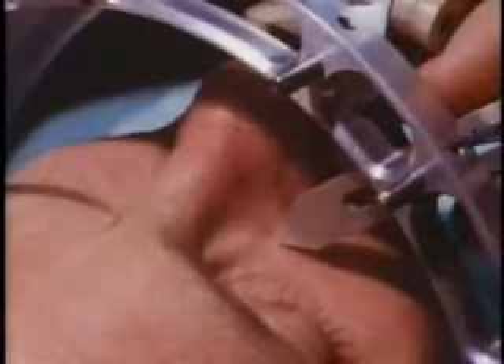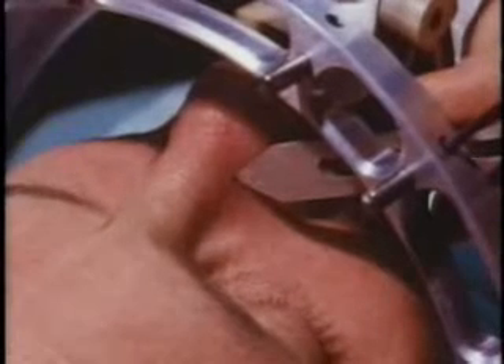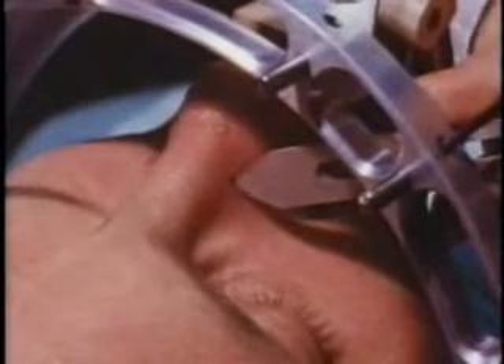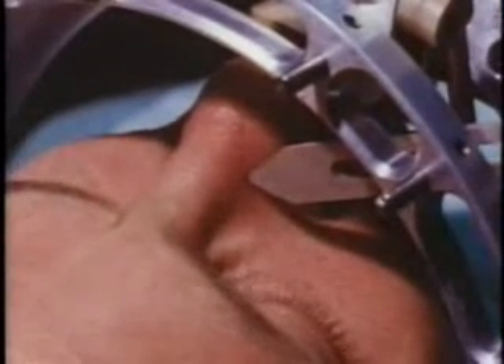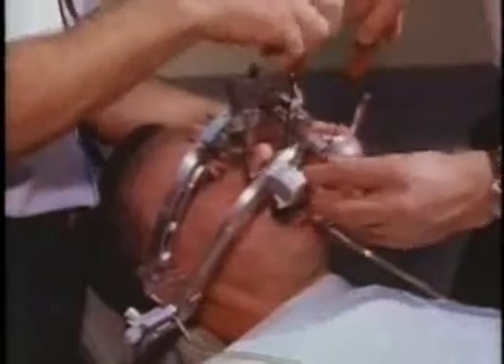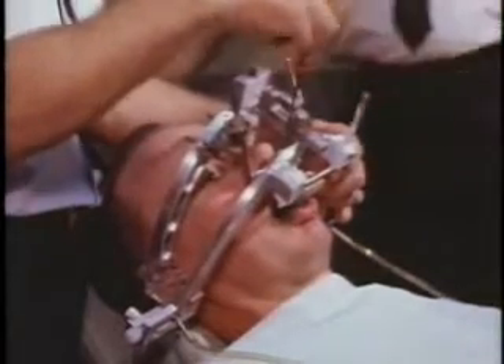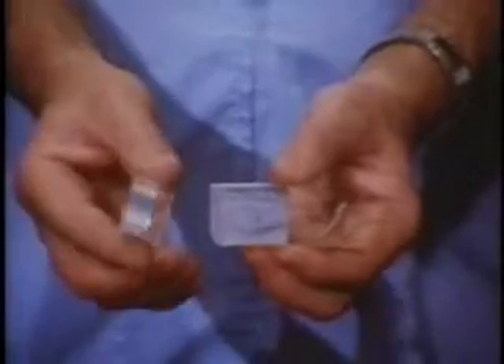The mandible is returned to centric relation with the recording drills inactivated. The anterior reference pointer is adjusted and secured to the orbital spot on the right side of the nose. Note that the orbital spot has been marked temporarily with dark ink for photographic clarity. The recording equipment is removed from the patient by loosening the attachment clamps. Here in these resin blocks are recorded in three dimensions the right and left lateral and protrusive movements of this patient's mandible.